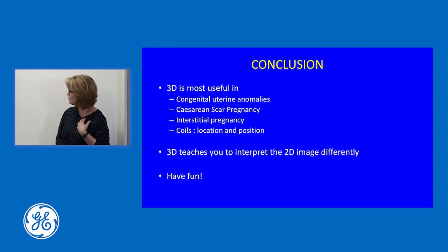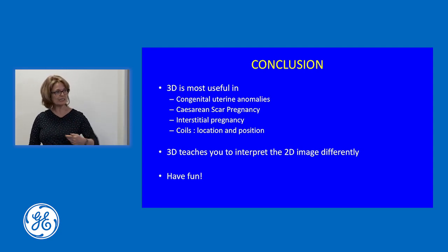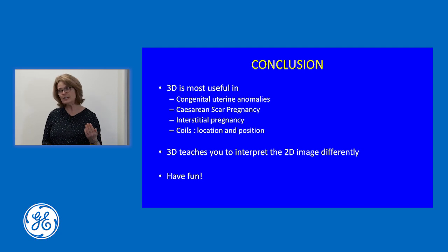And that from my perspective, certainly 3D has taught me to see my 2D differently. So in a lot of cases now, I don't necessarily need the 3D because I know what it's going to look like because I've done it that many times. But it has really taught me how to look at the image in a completely different view. So I would say don't be intimidated by it. Just learn the basics from these guys and just make a start. And you will enjoy doing it.